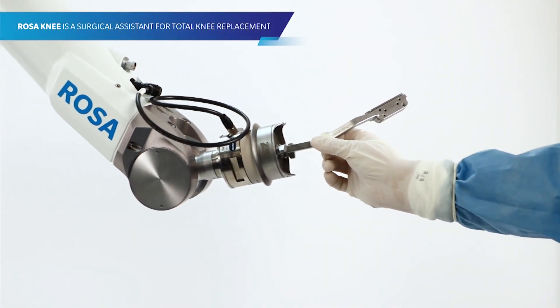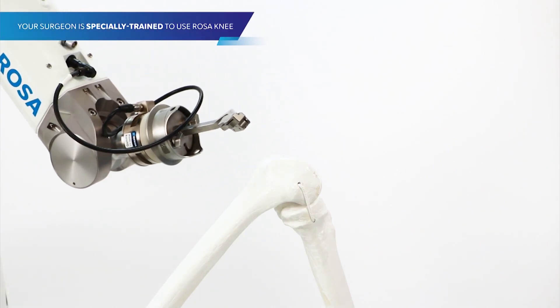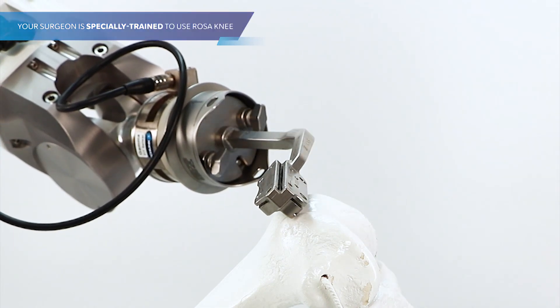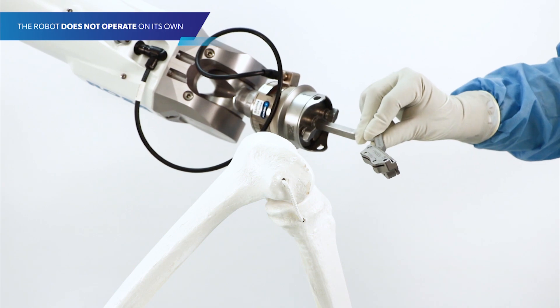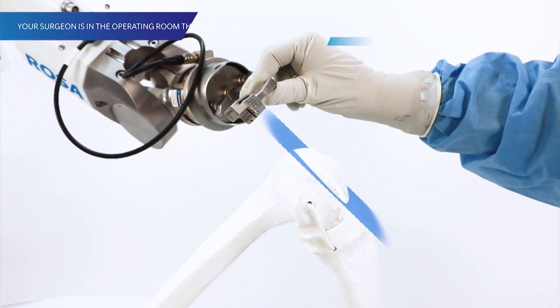Rosa Knee is a robotic surgical assistant for total knee replacement. Your surgeon is specially trained to use the robot. Rosa Knee does not operate on its own — your surgeon is in the operating room the entire time and making decisions throughout your surgery.